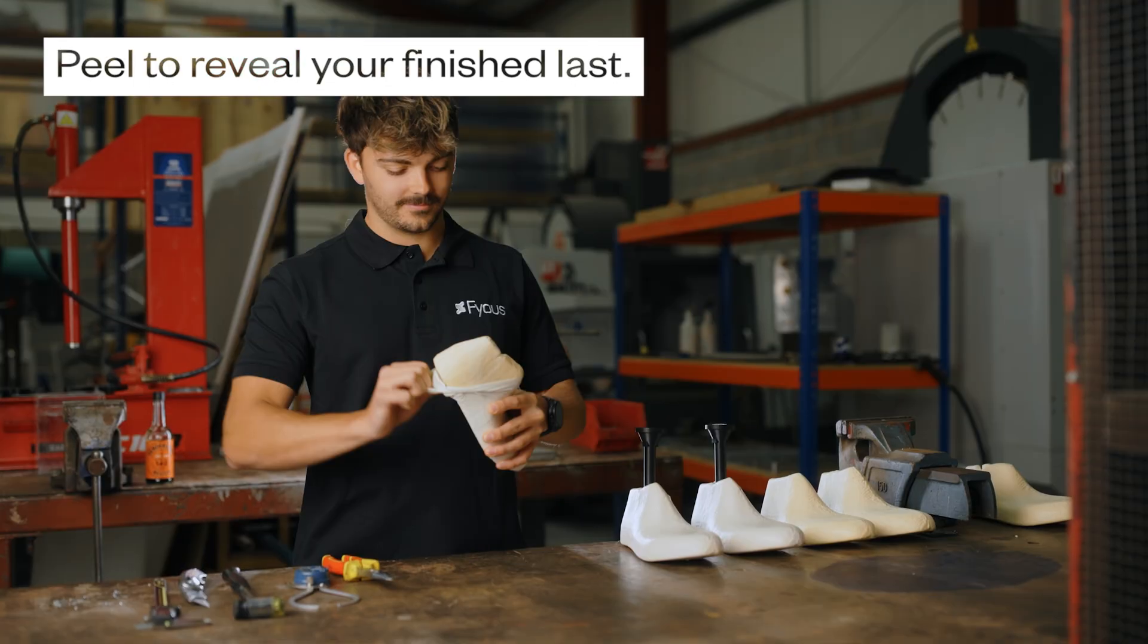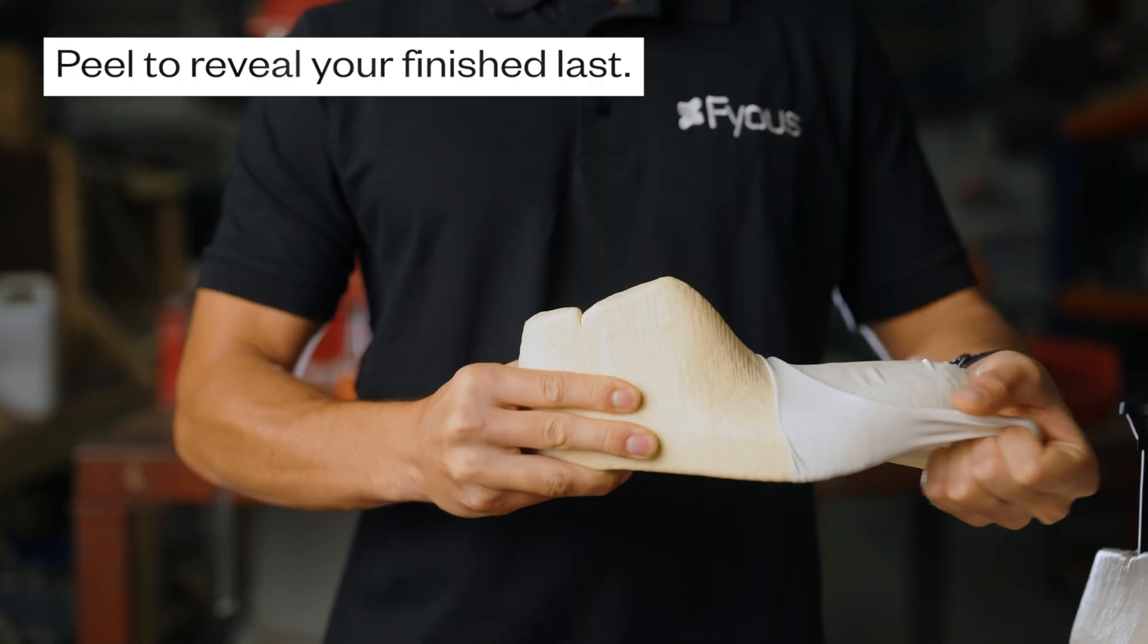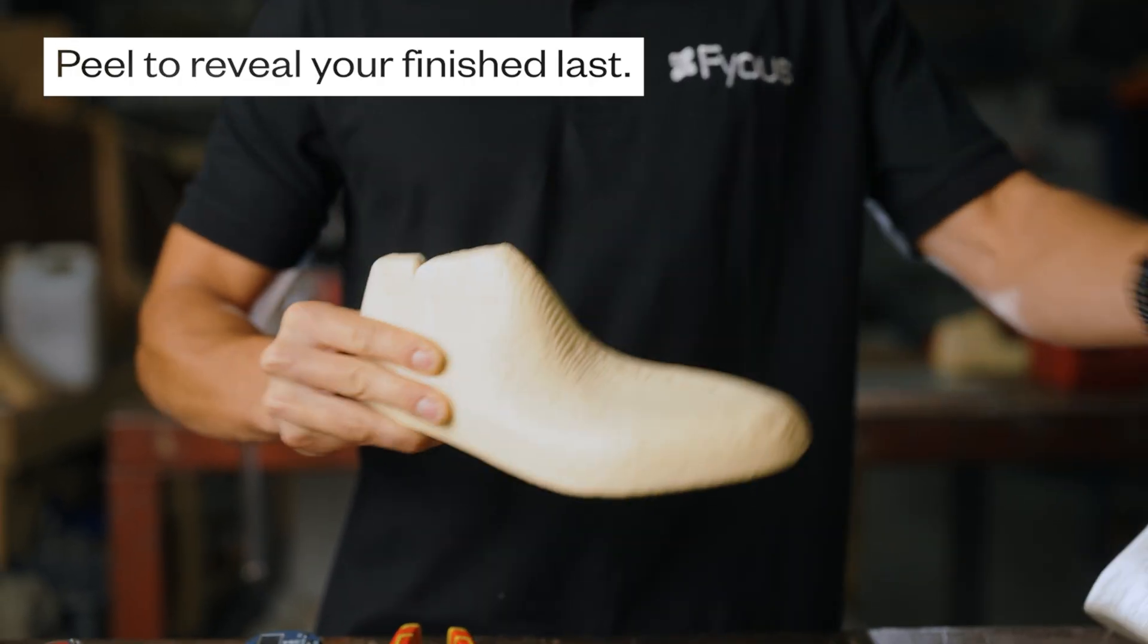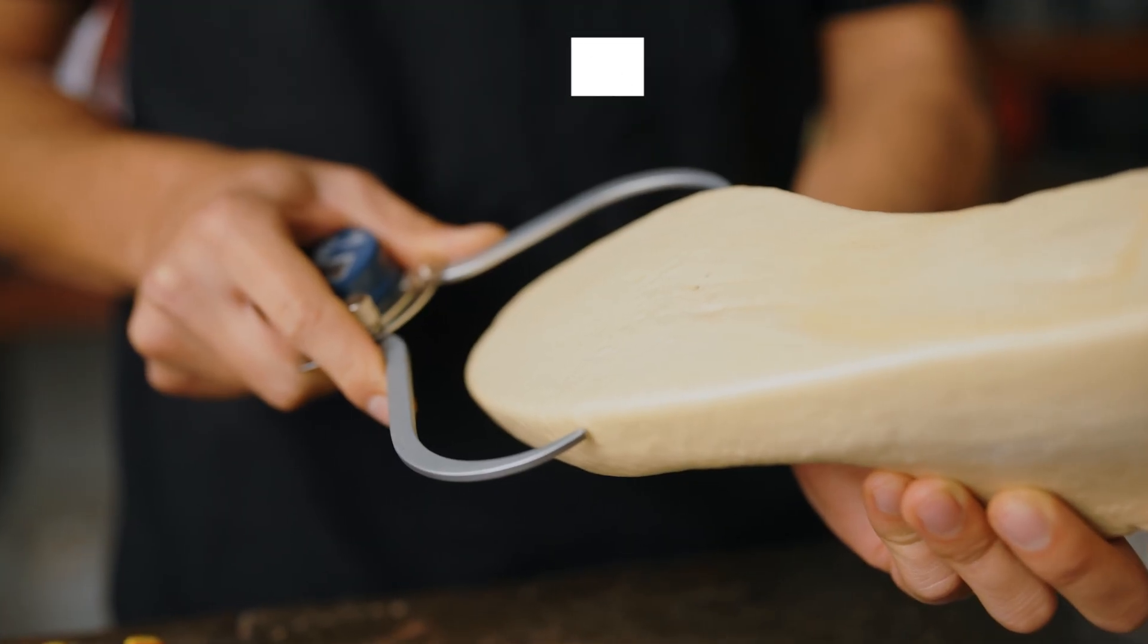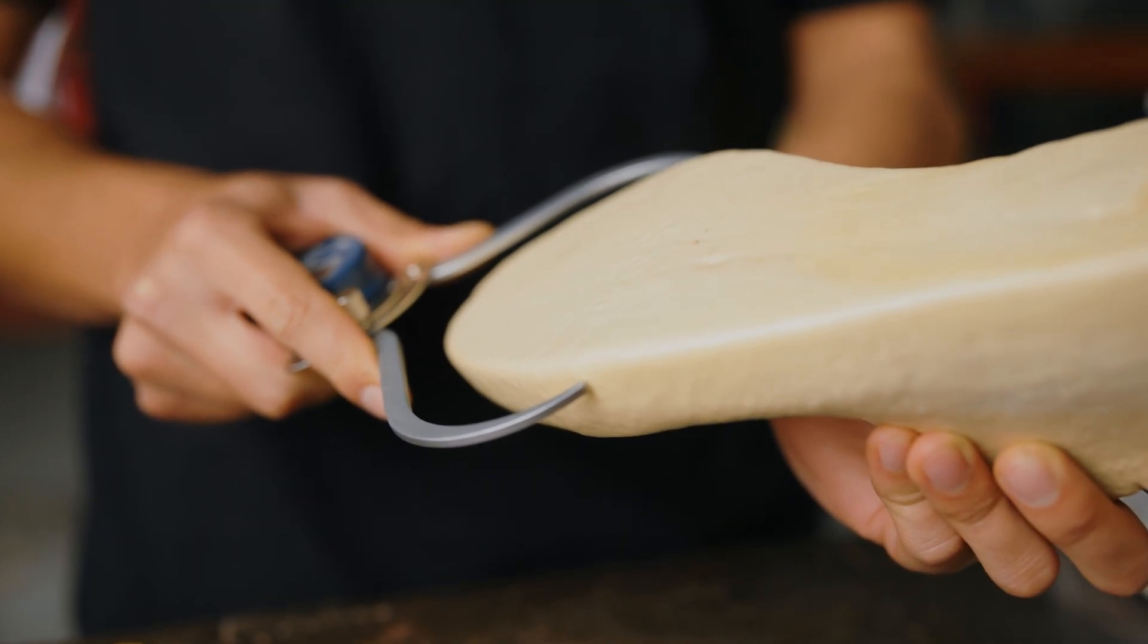Simply remove the membrane and you have your last, ready for your next stage in the production process.